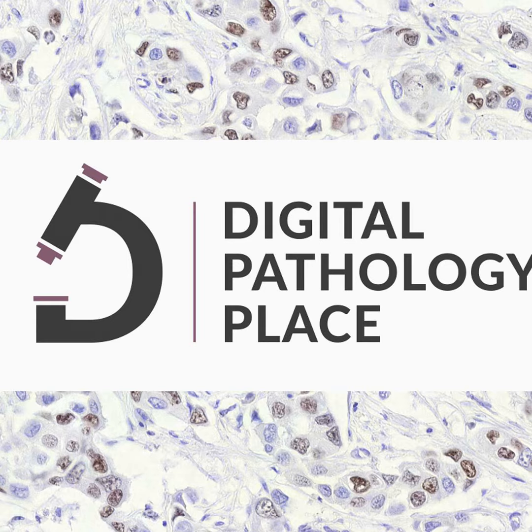We evaluated the proposed framework using breast whole slide images and benchmarked performance with state-of-the-art foundation models for domain generalization. And we're going to learn which these foundation models are in pathology. So they had a novel data set that was the same tissue slides scanned by two different scanning platforms. So here we're focusing very much on the scanner domain shift, and they did analysis of covariate shifts due to scanner bias.